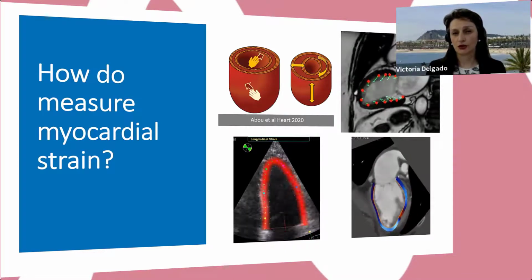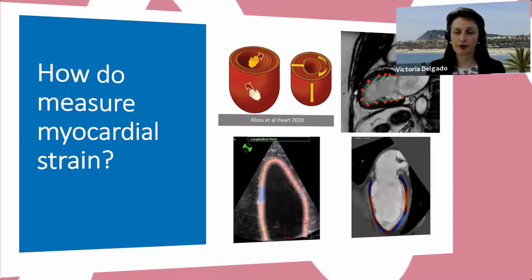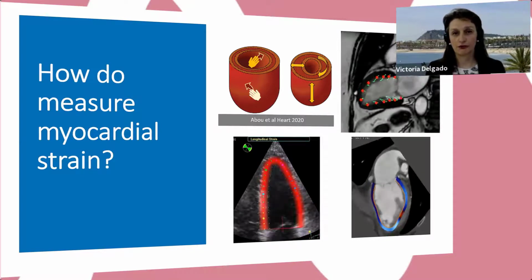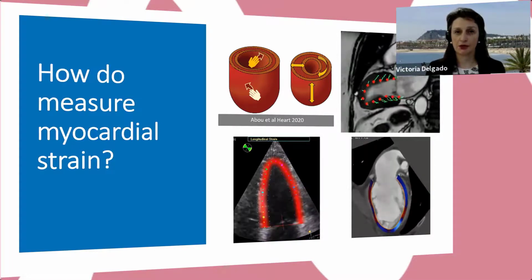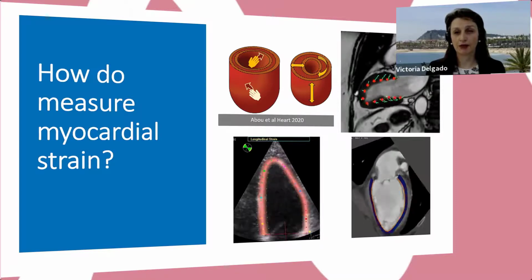We can measure all these deformations with echocardiography. We can also measure with feature tracking magnetic resonance, and most recently there have been developments that can measure the myocardial deformation on computed tomography data.